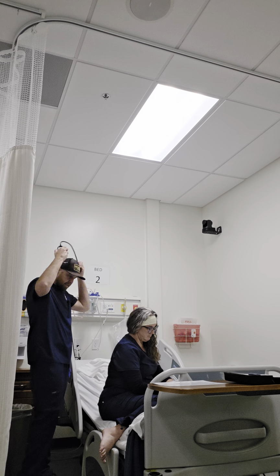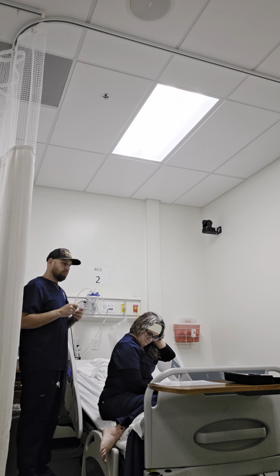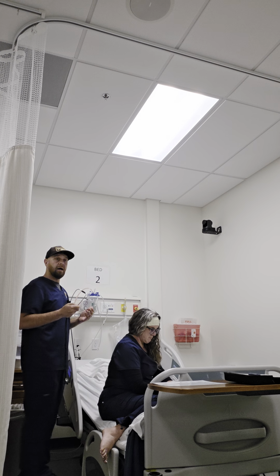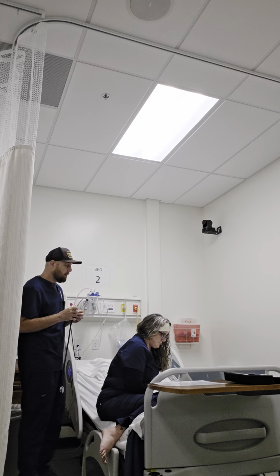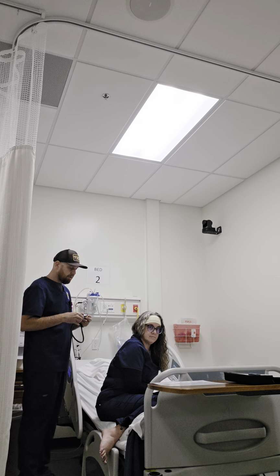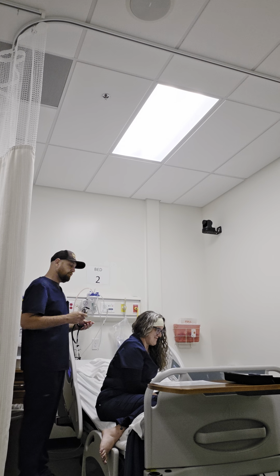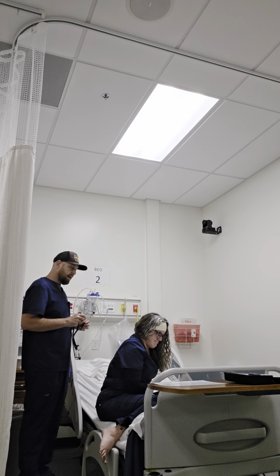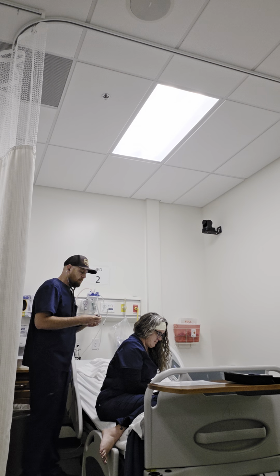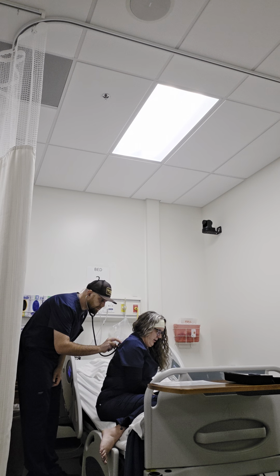Now I'm going to listen for breaths in the posterior thorax. Claire, I'm going to put the diaphragm of my stethoscope on a few different spots on your back. If you can take deep breaths for me when you feel the stethoscope touch your back, that would be helpful. Okay. Great. We're going to start. Right side. Take a breath for me.